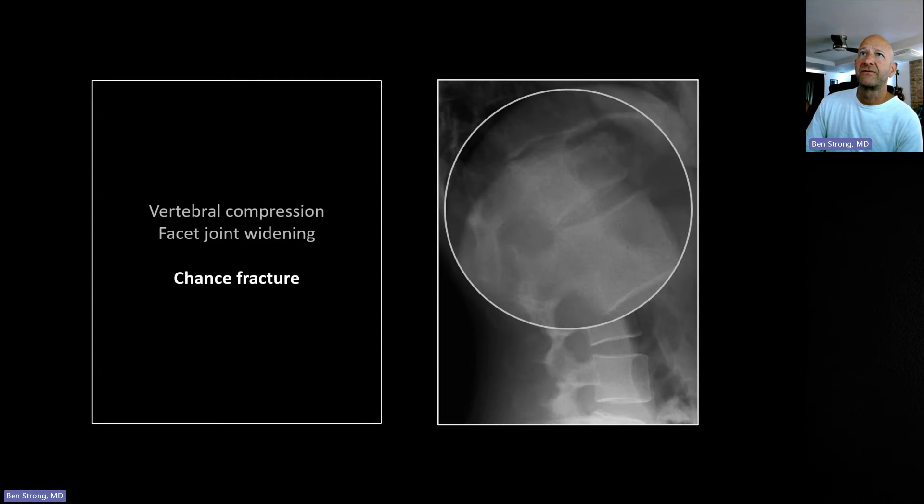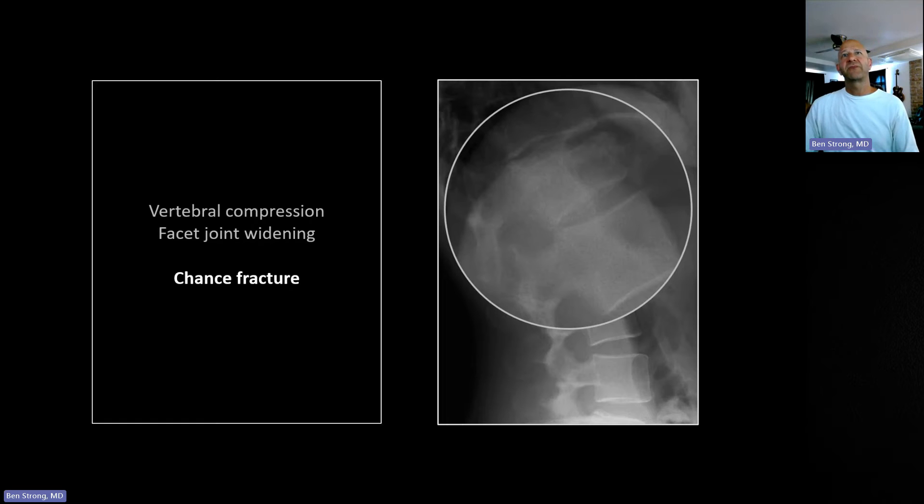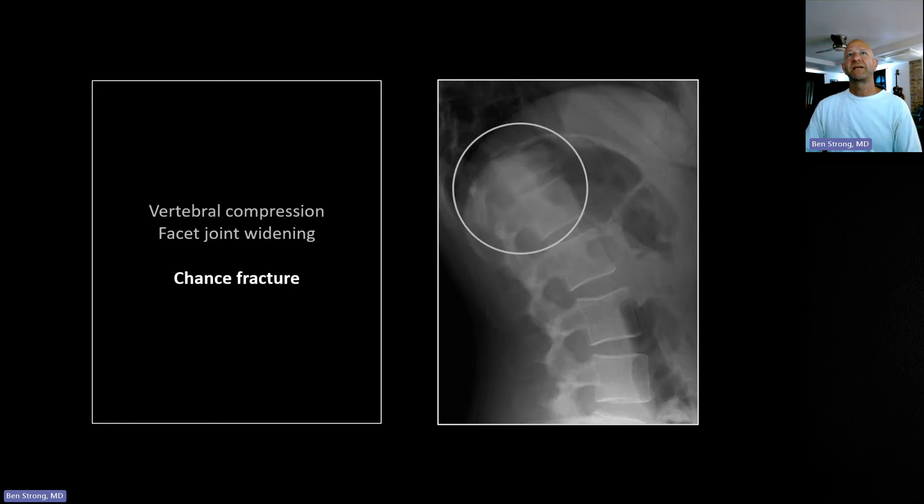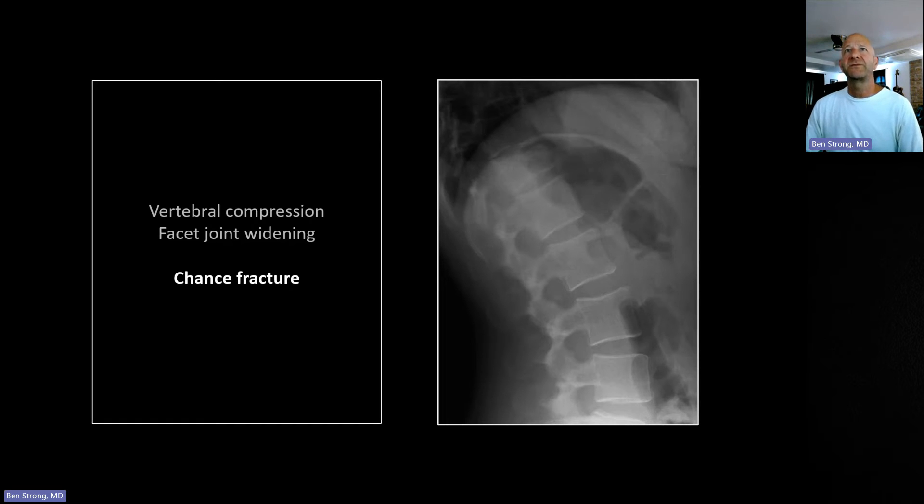So there you go: vertebral compression fracture and splayed facet joints.